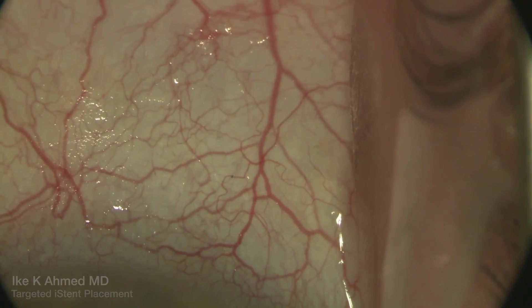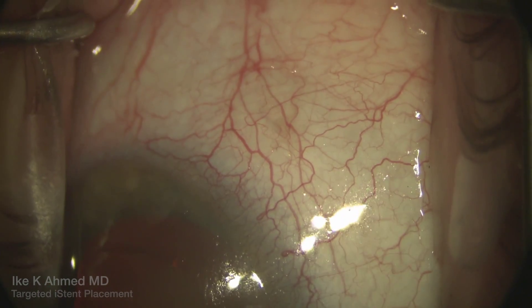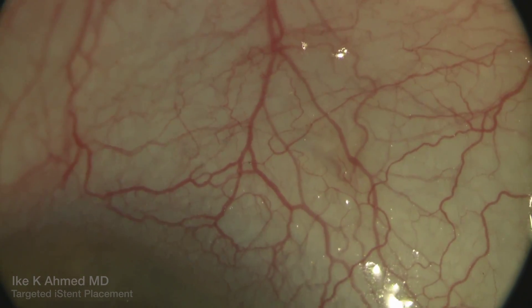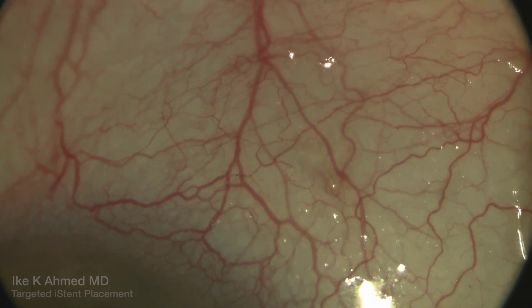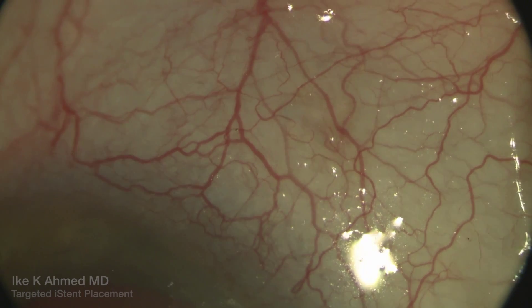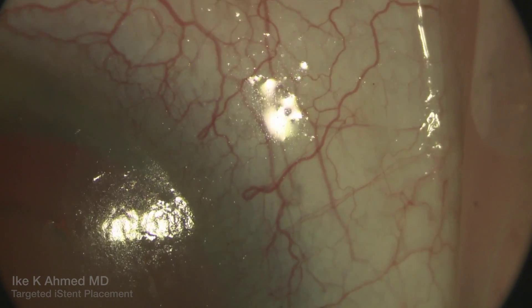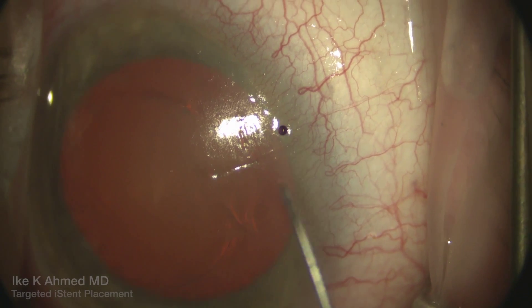Some of them are small caliber, some are large caliber, some are episcleral, and some are conjunctival. It's helpful to note the vessels that are more laminar in appearance with aqueous intermixed, as well as some clear areas as we get closer to the limbus, indicating this is a large aqueous vein coming off the canal directly. You can really see nice examples of these veins, including a supranasal one coming off in a more tangential manner.